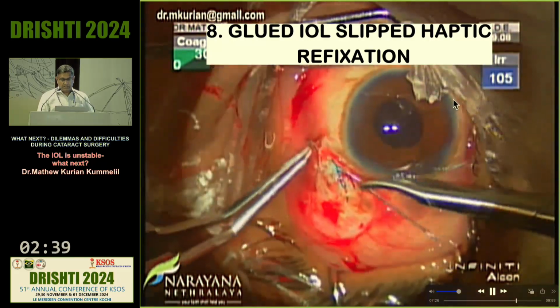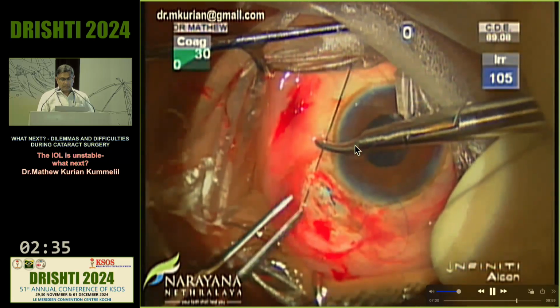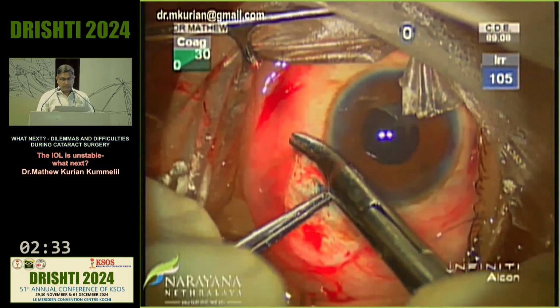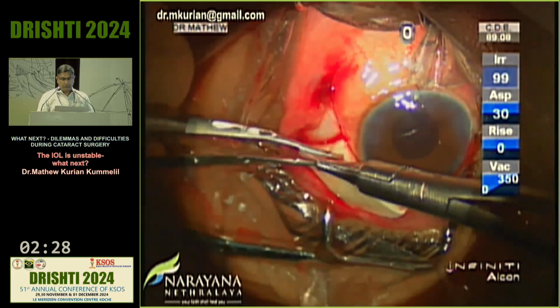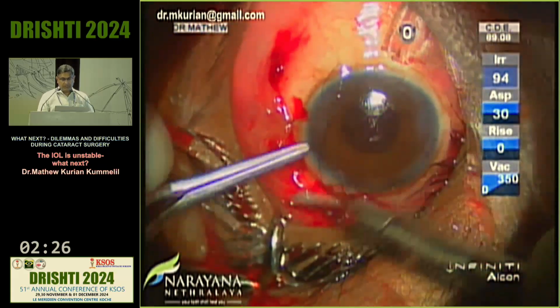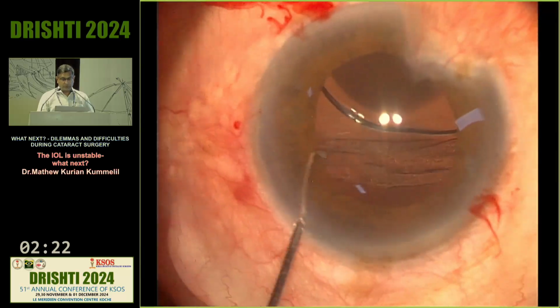So the other side is fixed well. So I've just exteriorized it. There is nothing in which to tuck it, no pocket, nothing. And at that time, this is before flanging techniques were there. So I just sutured it and put a scleral patch graft to close the place.